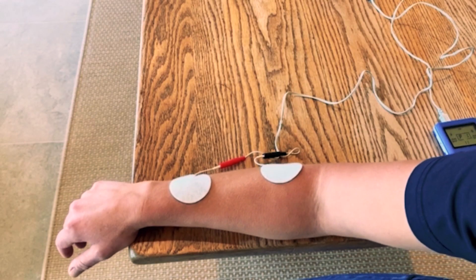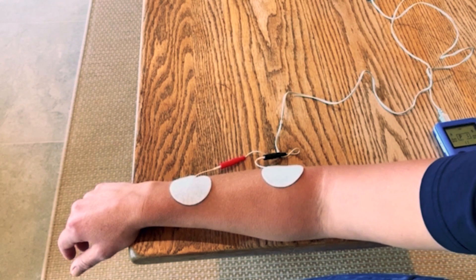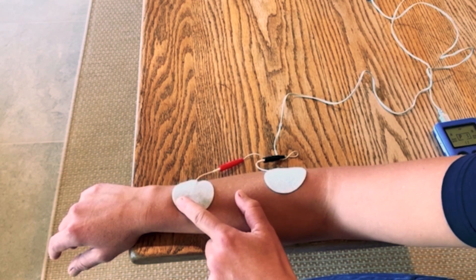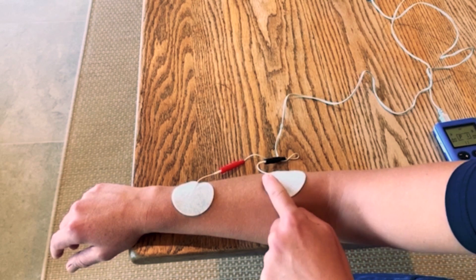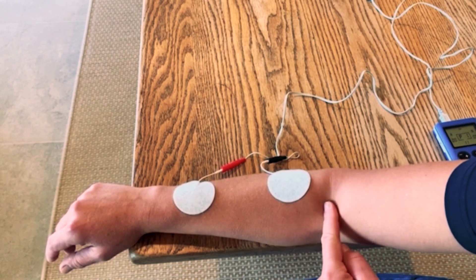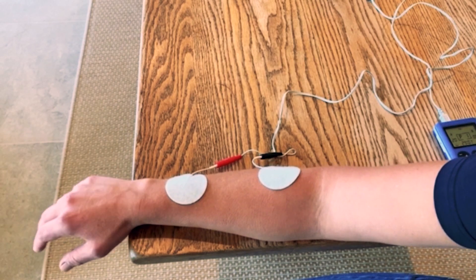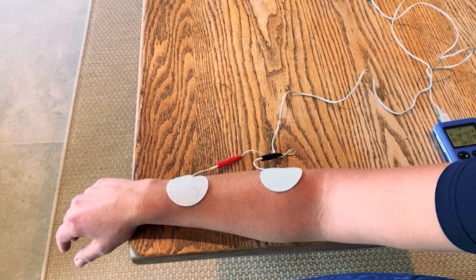In this video, I'm going to show you electrode placement to get wrist and finger extension. One electrode over the motor point of the wrist and finger extensors, one electrode over the fleshy part of the forearm. You can see where that comes in relation to the elbow crease, and that gives you wrist and finger extension together.